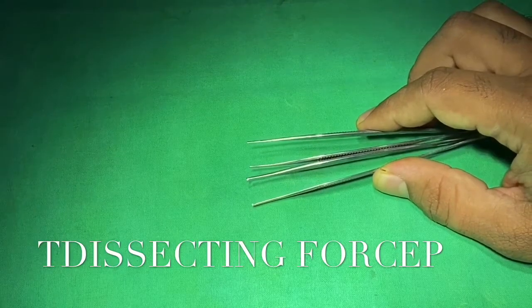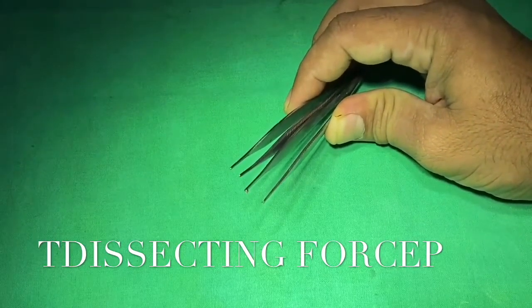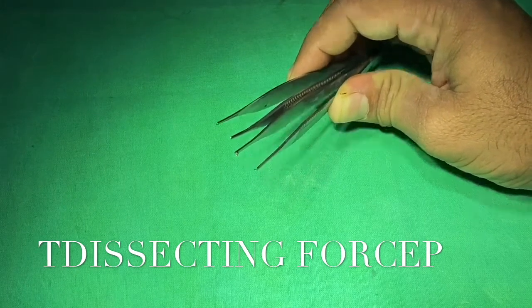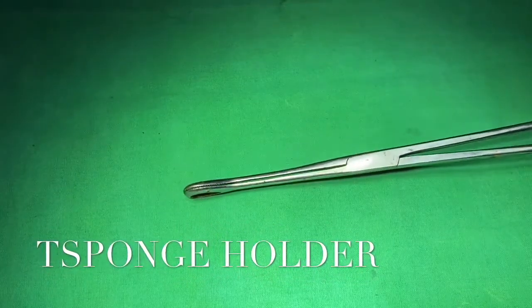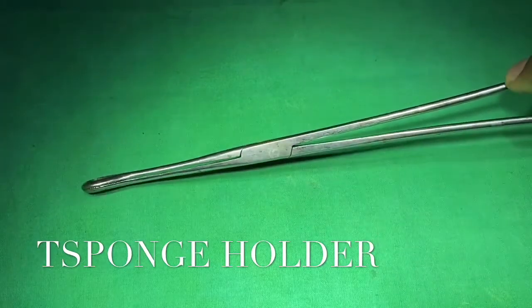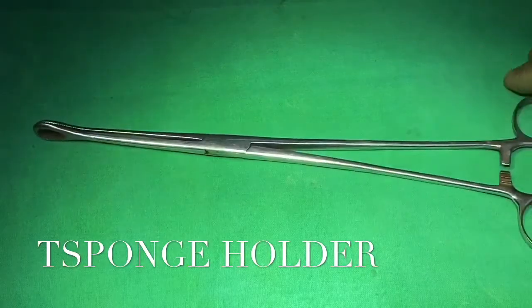Toothed forceps are also called tissue holding forceps. Toothed forceps are used to hold harder structures like skin, whereas untoothed or plain forceps are used to hold softer tissues like intestine walls. This is a sponge holding forceps, used to hold the sponge at the time of painting the operative site.